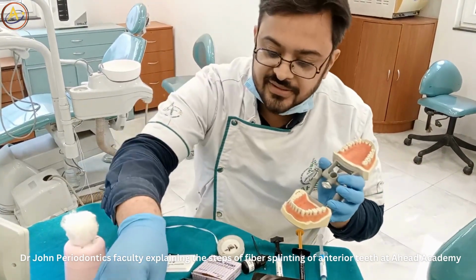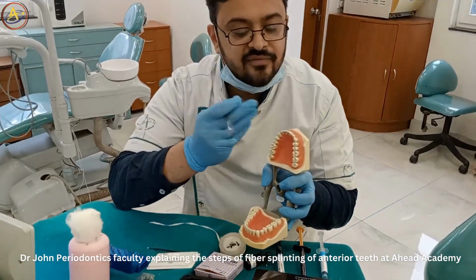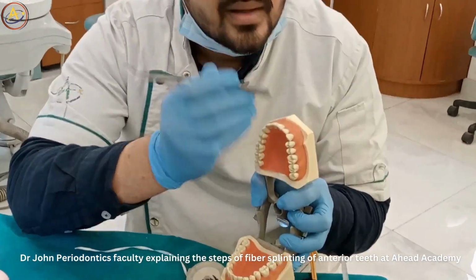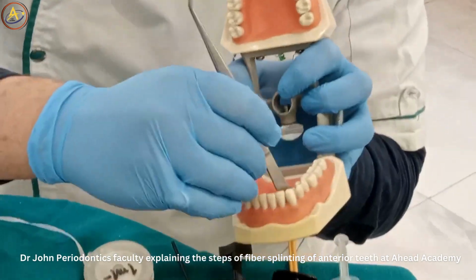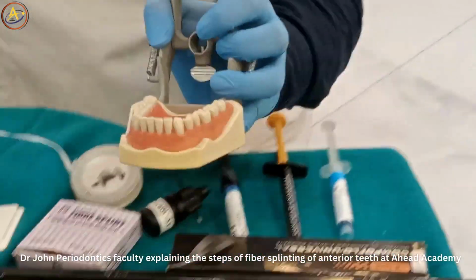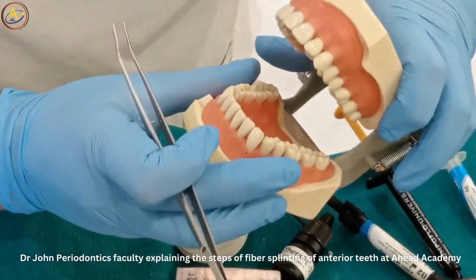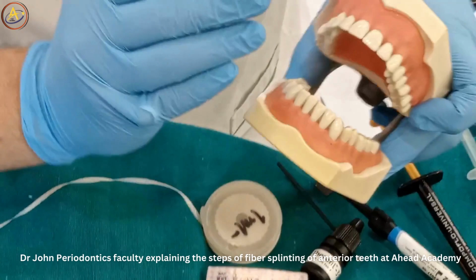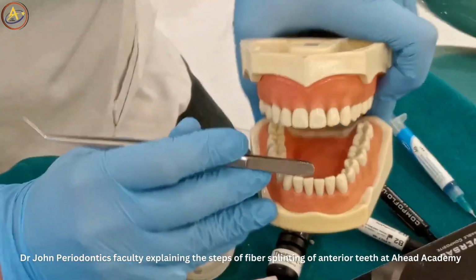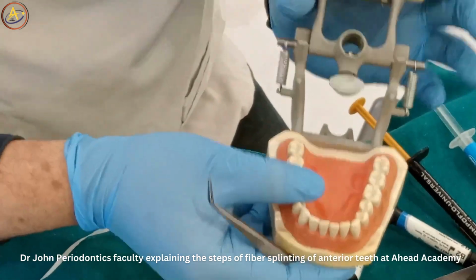Now, first thing first, always have an idea how to start about it. If you have the maxillary tooth, splinting is done buccally. If you have the mandible tooth, splinting is done lingually. Now get an idea why. If you do a mandible tooth splinting buccally, your maxilla will come and hit the teeth. Chances are the splinting will get away. Same with the maxilla. So mandible teeth is done lingually, maxilla is done buccally. Okay? First of all.